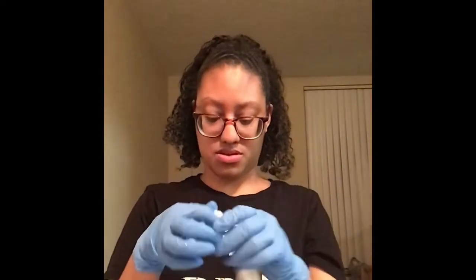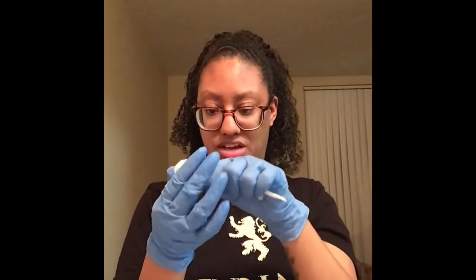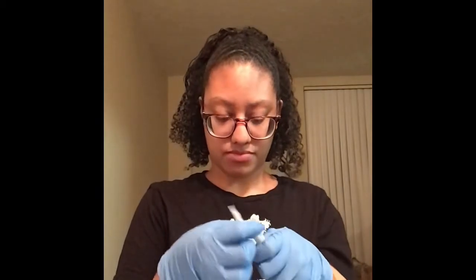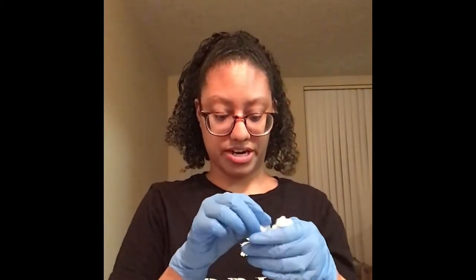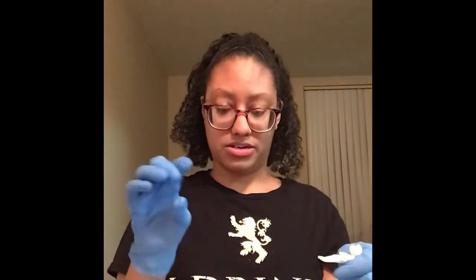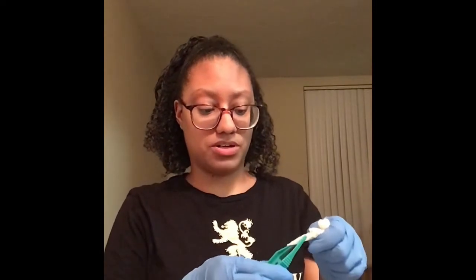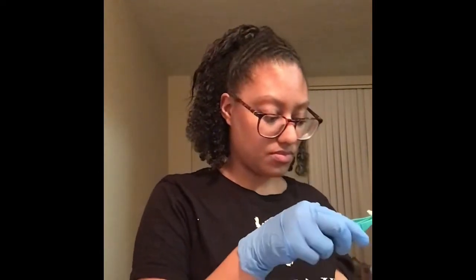There we go. And you're going to kind of snake it in your hand. You can use either hand for this. And again, don't touch your face because I almost just did just now. You're going to grab your tweezers and you are going to feed this Curlex into your wound, starting from top to bottom.